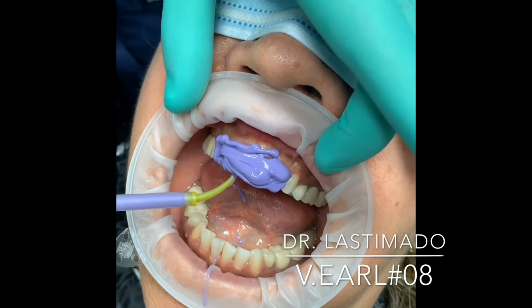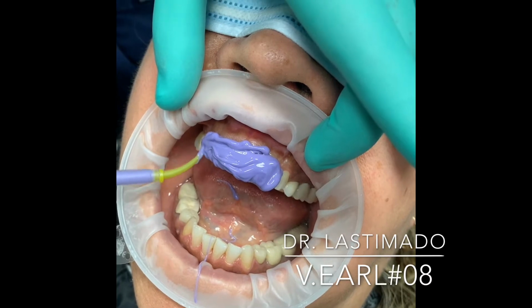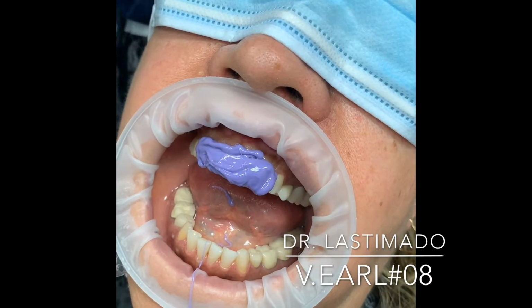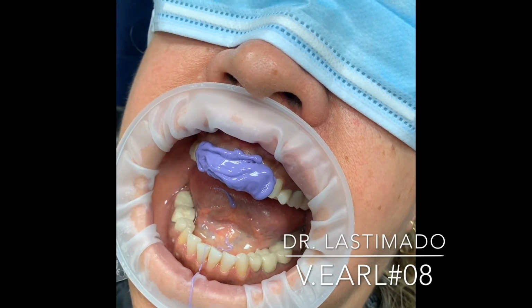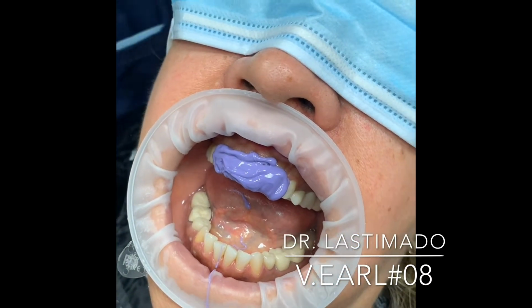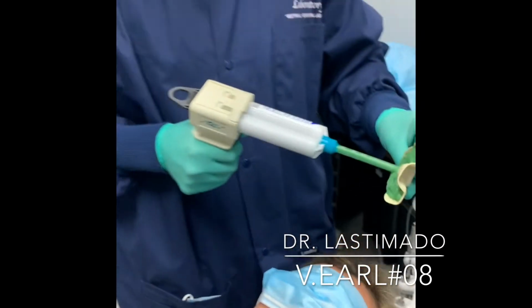Then on the cast we remove the tooth and either throw in a denture tooth or wax up an ideal tooth of number 9. And then, as you'll see, we'll fabricate the surgical open guide real quick. It's a real straightforward process, and it gives you a reference, because if we have no reference, then we're basically guessing how deep that anterior implant goes.